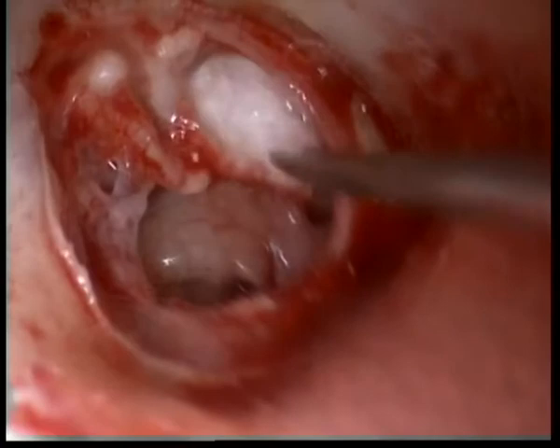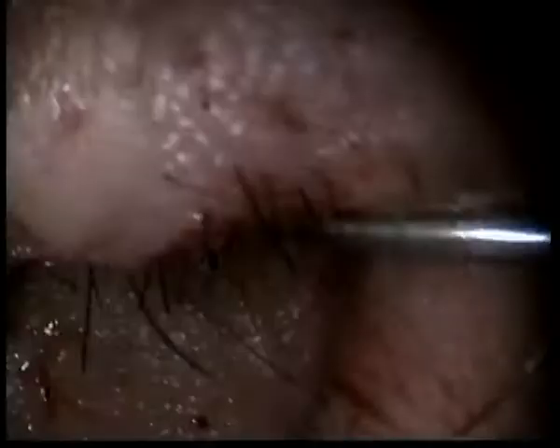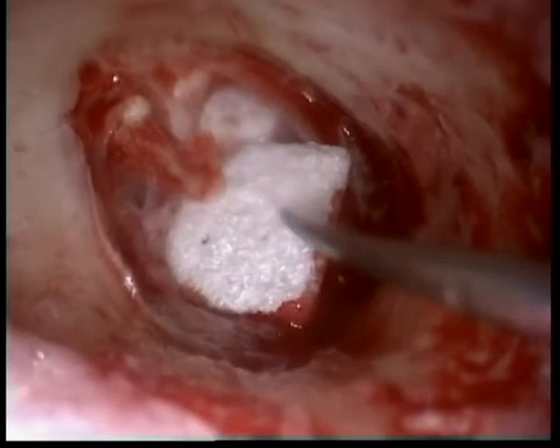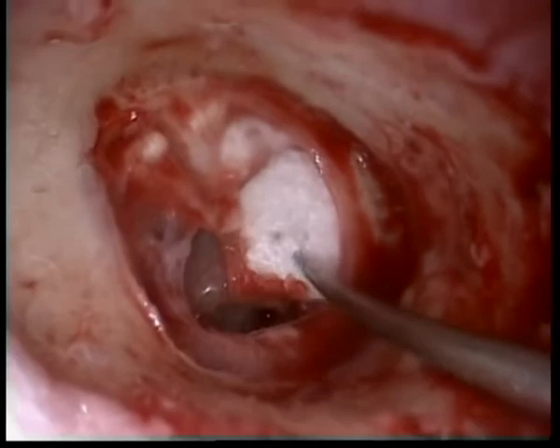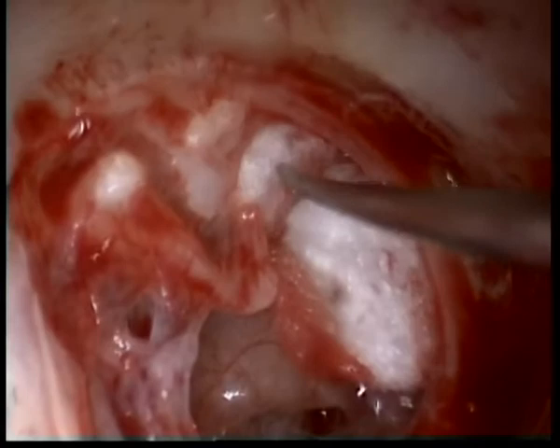I especially like to pack the upper anterior quadrant, because that's where things fall off usually, anterior to the handle of the malleus. Don't make it any bigger than this. No, smaller, I would say, even smaller. Smaller? Yeah, I think I need smaller, but anyway, okay. Get it down to the size.